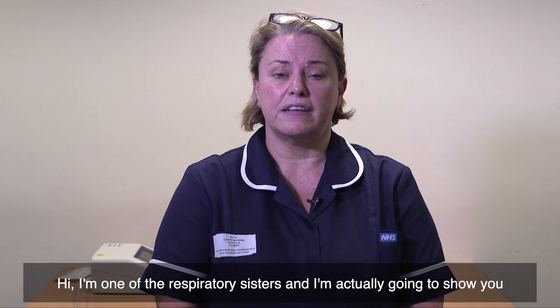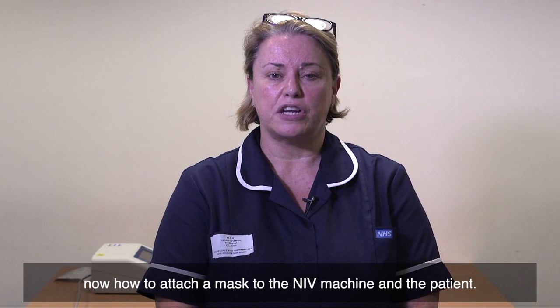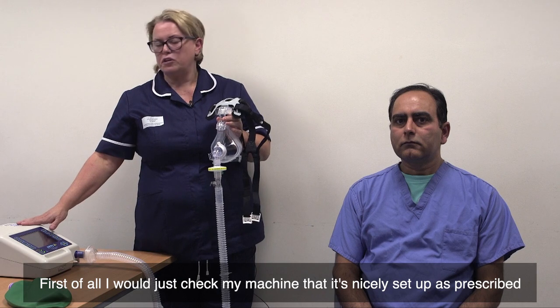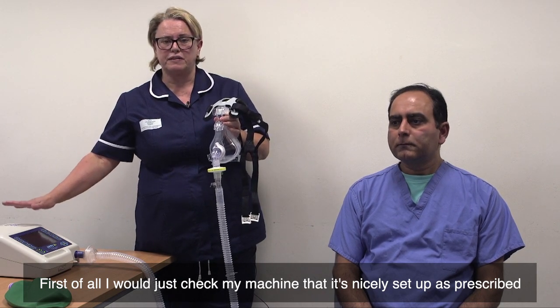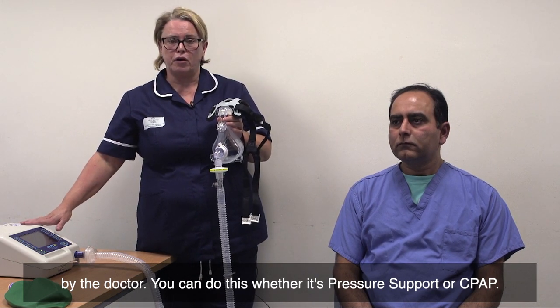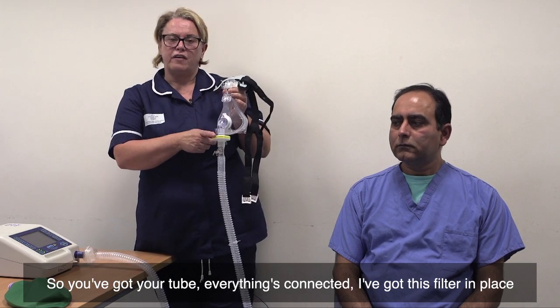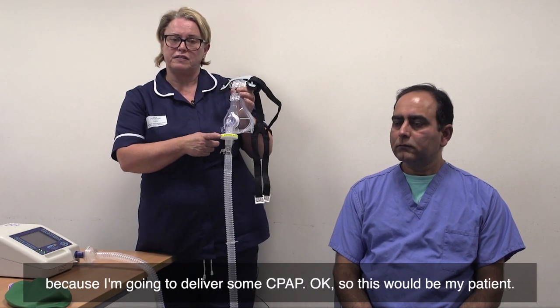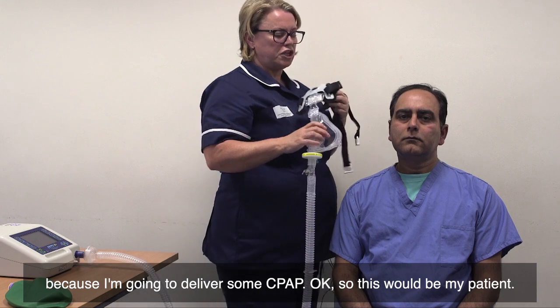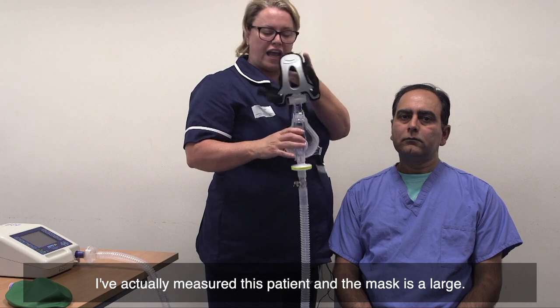Hi, I'm one of the respiratory sisters, and I'm going to show you now how to attach a mask to the NIV machine and the patient. First of all, I would just check my machine that it's nicely set up as prescribed by the doctor — you can do this whether it's pressure support or CPAP. So you've got your tube, everything's connected, with the filter in place because I'm going to deliver some CPAP. This would be my patient — I've measured them and the mask size is large.